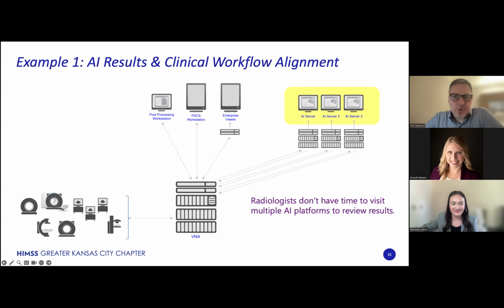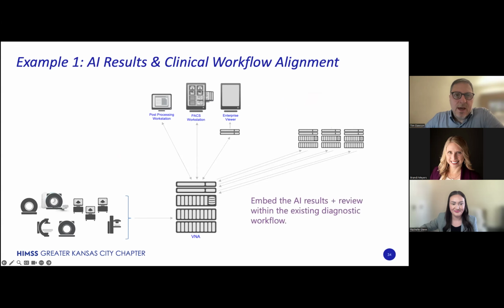Radiologists hate extra clicks, and they certainly don't want to take the time to go launch another system unless there's something really important for them. So what we really want to do is take those results and embed them directly into their PACS viewers. Again, the same thing can be done by taking results and providing them automatically to other specialists directly in their workflows.